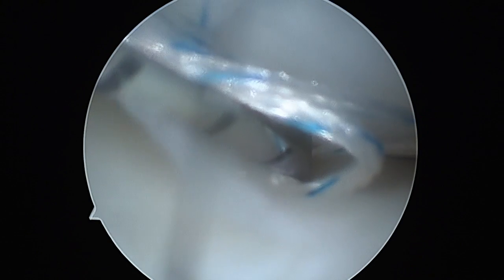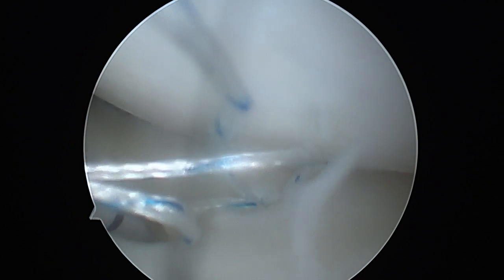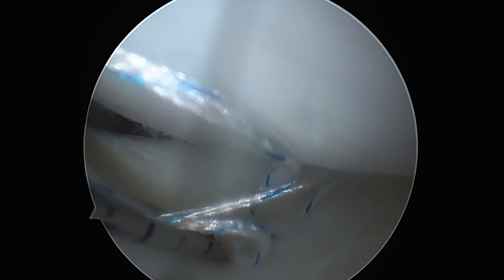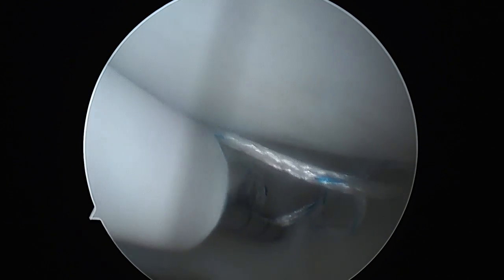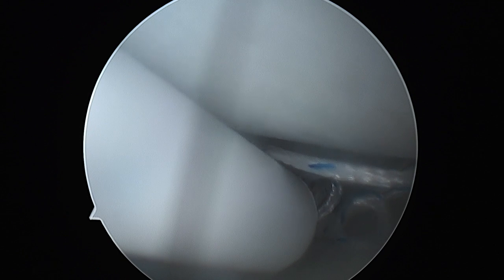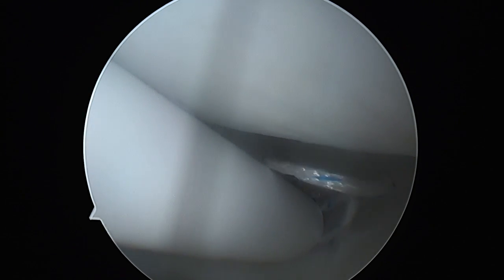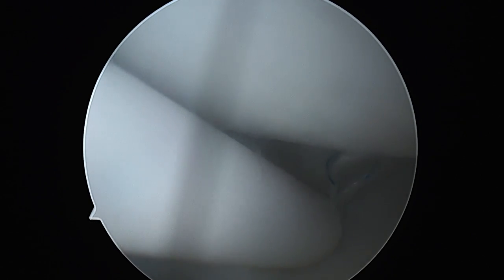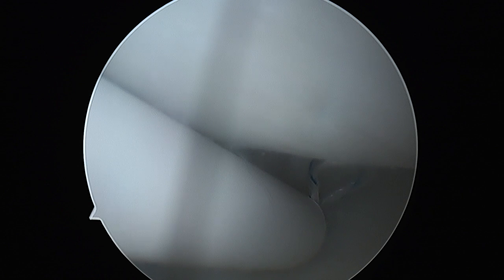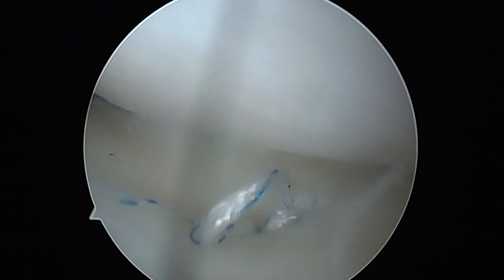Approximately 5 mm away, the needle is again introduced with gentle rotatory movements in the same way as it was introduced previously. The anchor is then released again and the device gently pulled out.